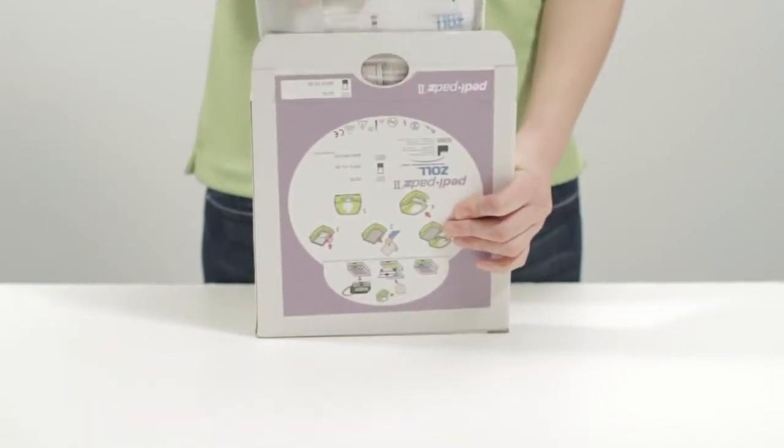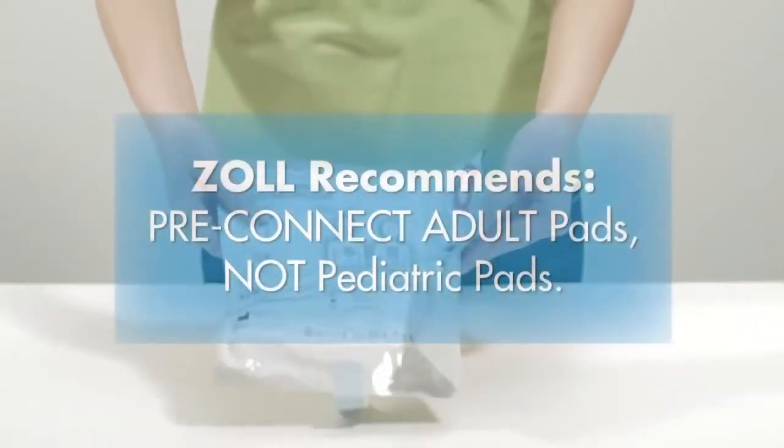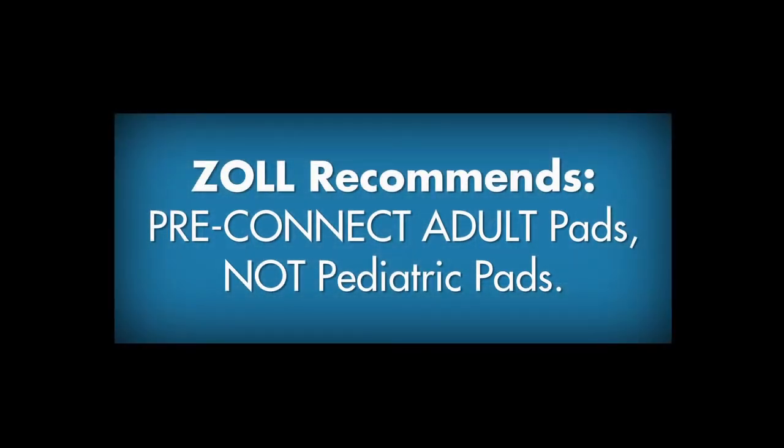The process for installing pediatric pads is similar. ZOLL recommends, however, that you pre-connect CPRD pads, which are for adults, and not pediatric pads. An adult emergency is much more likely than a pediatric one, even in places where many children are present.